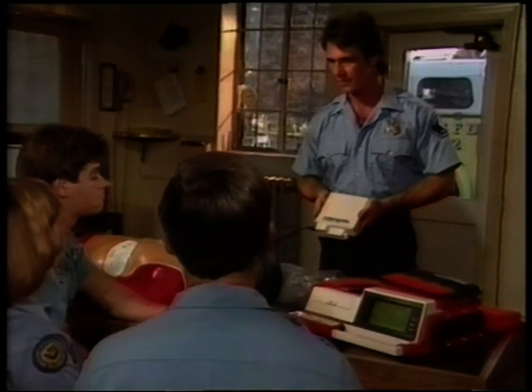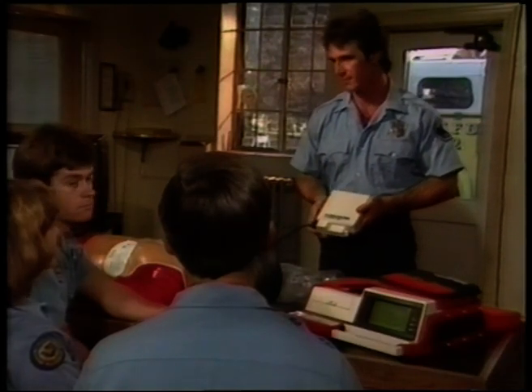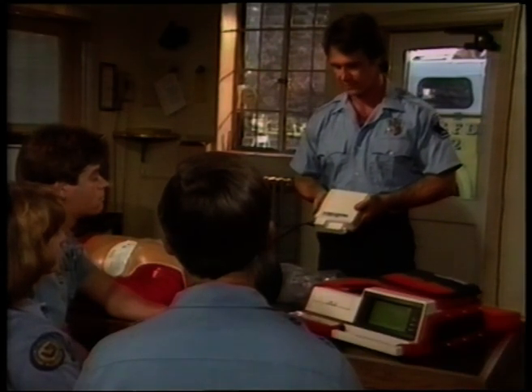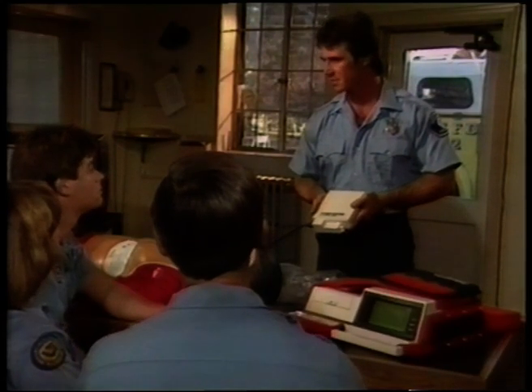The battery should be left on for a minimum of 16 hours to ensure full charge. Leaving the battery connected to the charger will not damage the battery. In fact, continuous charge is highly recommended.